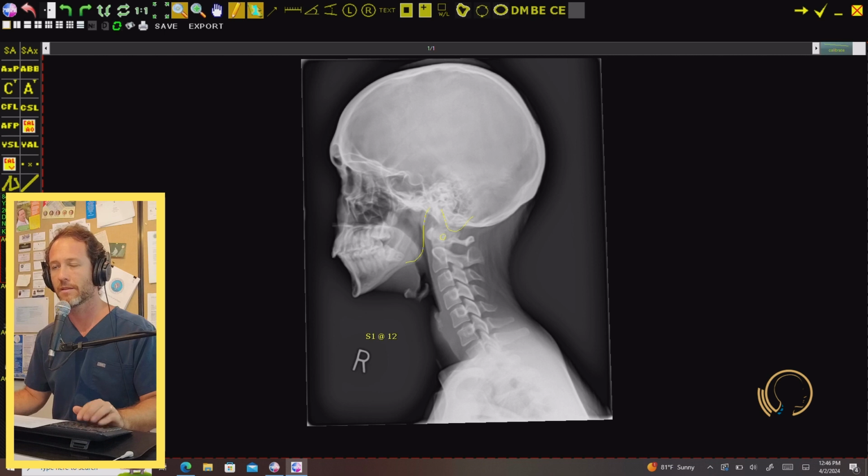And the real question, and I didn't introduce this on the frontal film video, but why even analyze and have a systematic X-ray analysis protocol for your procedure? And the line is, patients don't get well from being adjusted. They get well from holding an adjustment. So the purpose of these films, right?